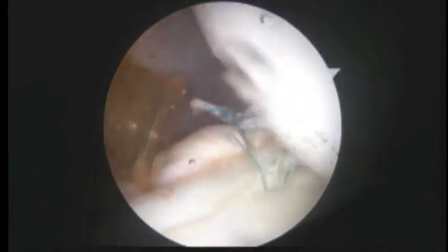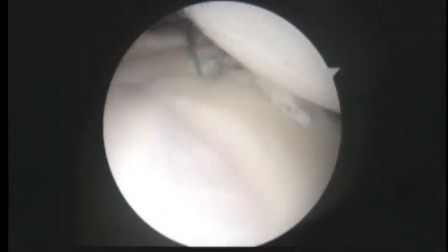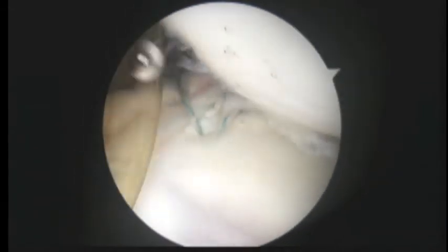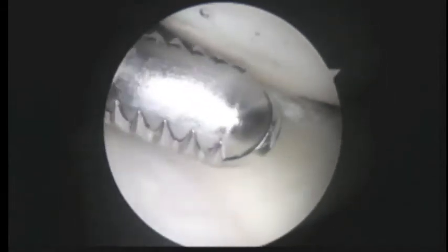So there's the first one tied, that's in the back. And we've really tried to bunch that up quite a bit on purpose. We'll take our shaver here in the back next, trying to debride a little bit, and then we're gonna get to work in the front of the shoulder. Here's our shaver coming down.